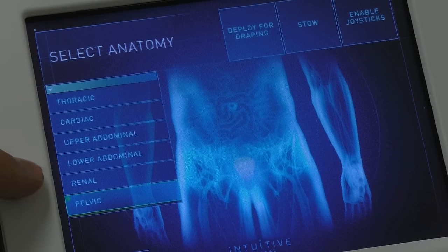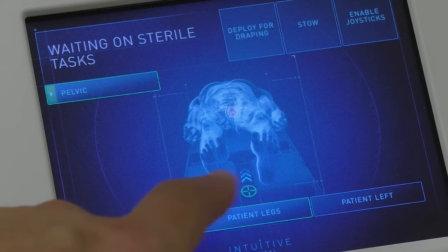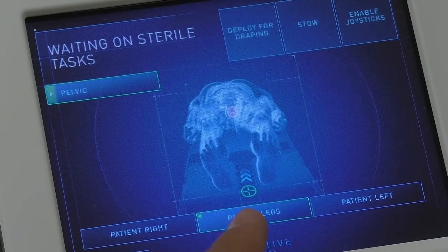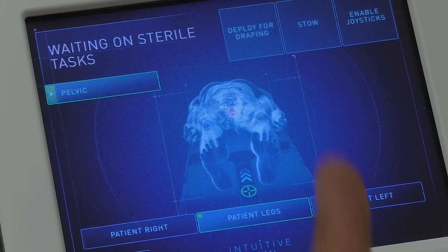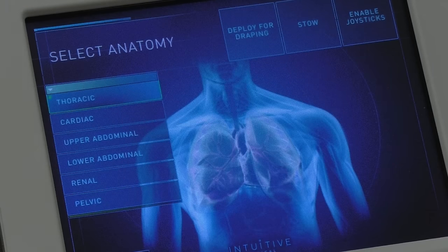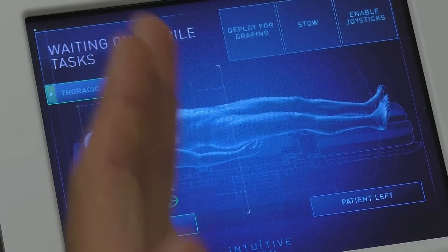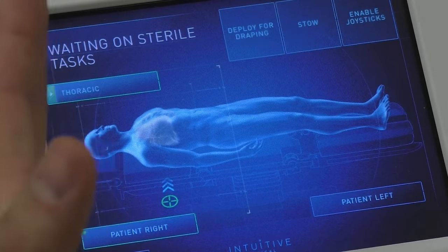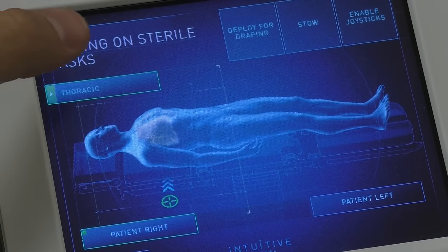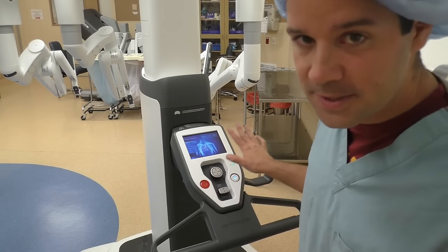This menu helps nurses know where to dock for the specific type of case. Say it was a pelvic case with the patient in stirrups — the robot is going to be coming down from the bottom, between the patient's legs. For a thoracic case like a right upper lobectomy, we're coming in on the patient's right side, directly adjacent to the patient, further up the body over the chest cavity.